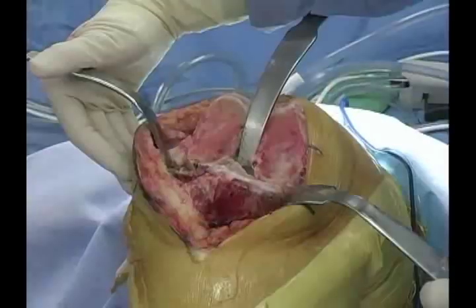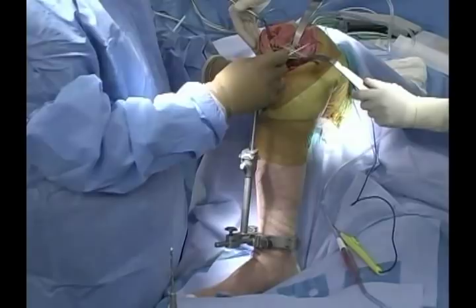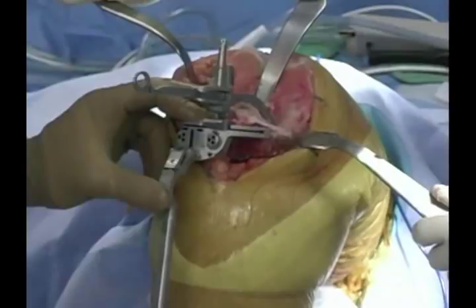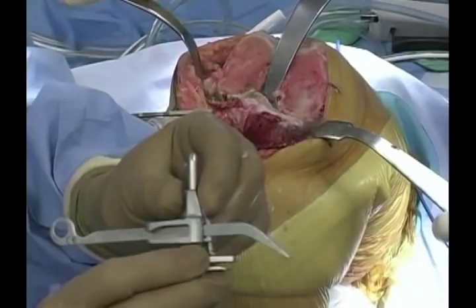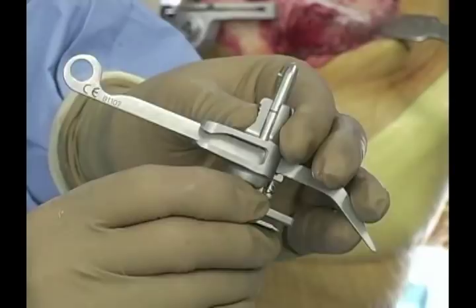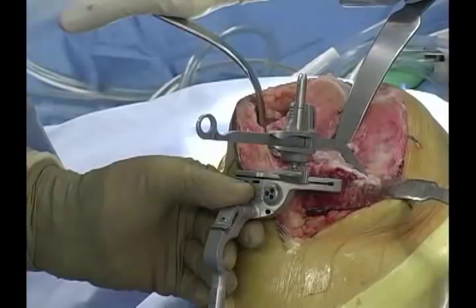We can choose to cut on the side or on the top of the block, and we can measure off the high or the low side. In this particular case, I'm going to measure off the low side because she has a fairly large defect. The depth gauge moves up and down in two millimeter increments from zero up to 12, and can be used on the non-slotted or slotted side based on your preference.